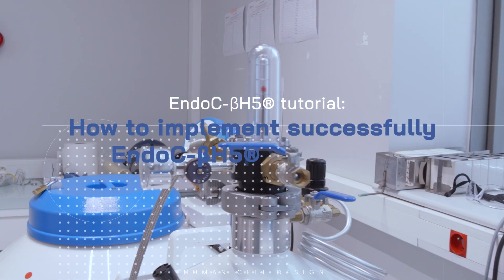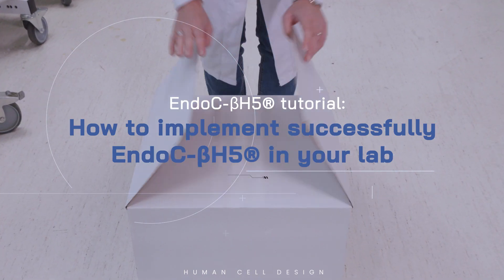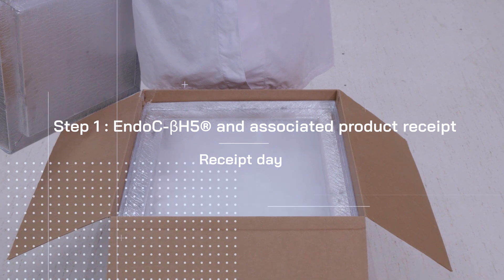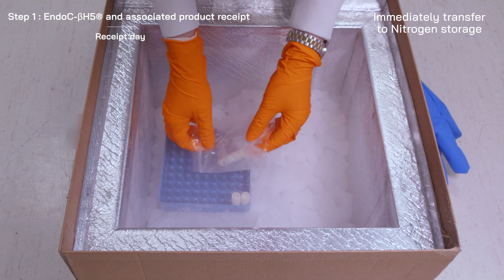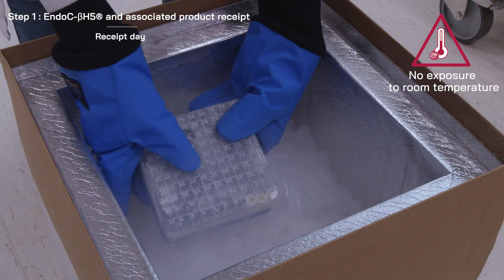Unlock the potential of diabetes research by integrating Endo-CBH5 into your laboratory. On receipt, immediately transfer the cryovial of Endo-CBH5 to nitrogen storage. Avoid exposure to room temperature as far as possible.